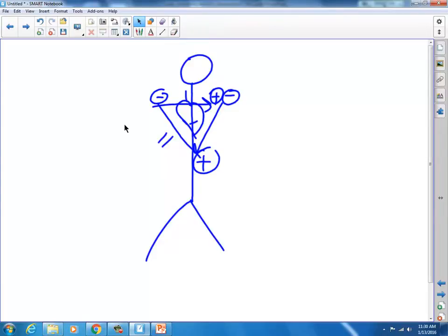So each line just depicts how the picture is being taken. All right? So, let's look at it. If I am trying to get a lead 2 view, where is my positive electrode or my positive lead? The left leg. So my negative is going to be my right arm. All right?